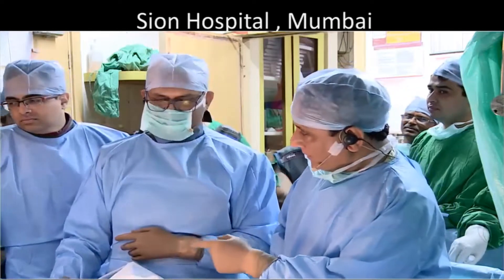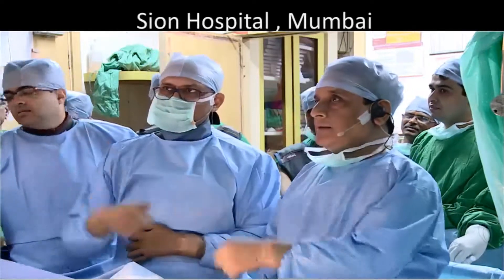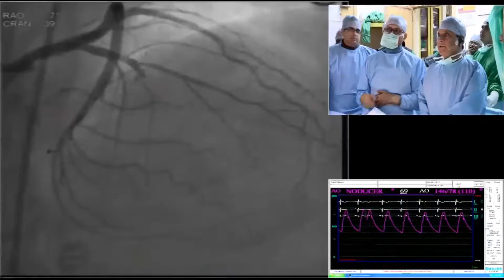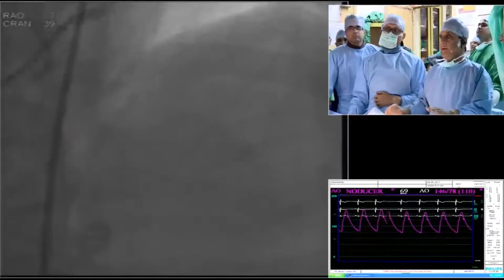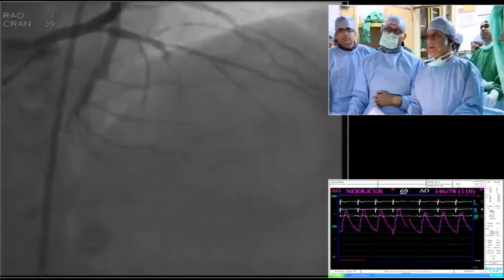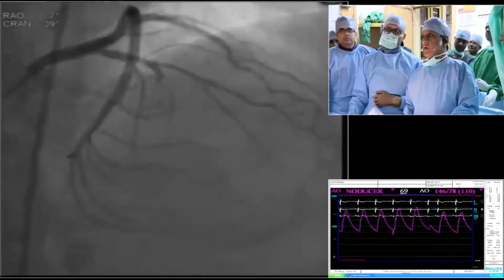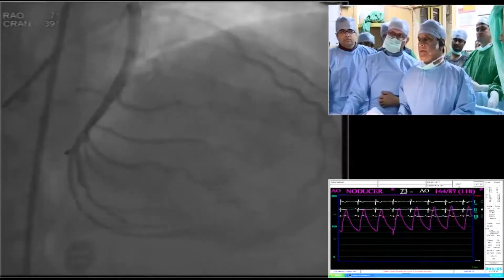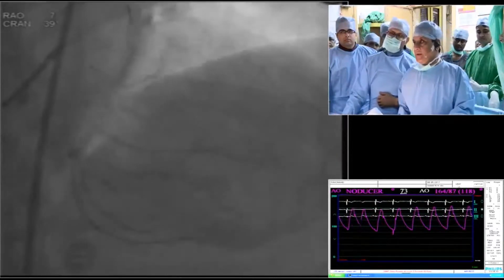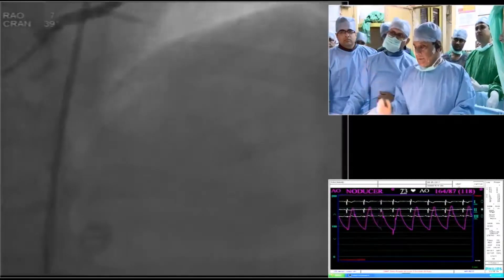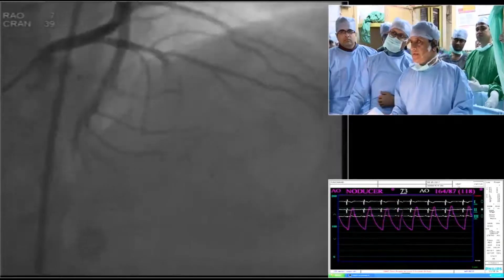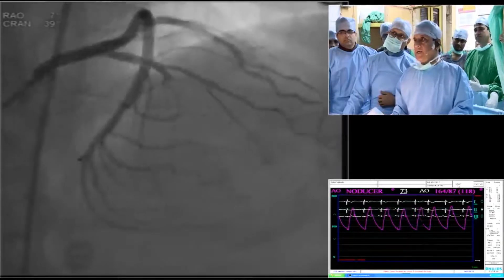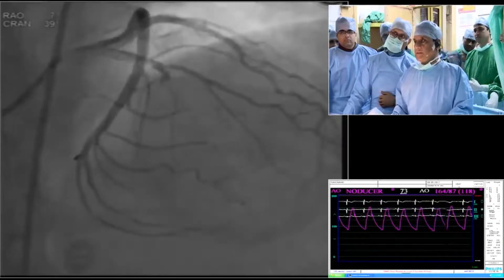We can play that. Now, you see here there is a total occlusion of the LAD after the septal and the diagonal. You see the distal LAD fills by the collateral. It's a left-dominant system.